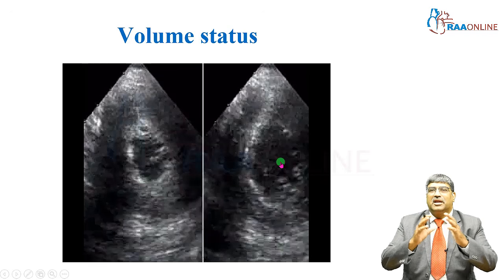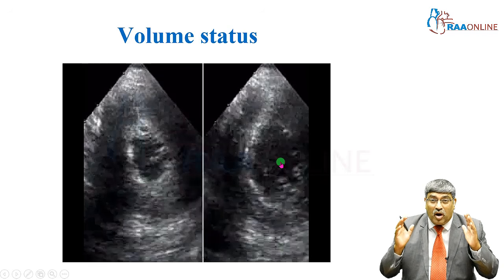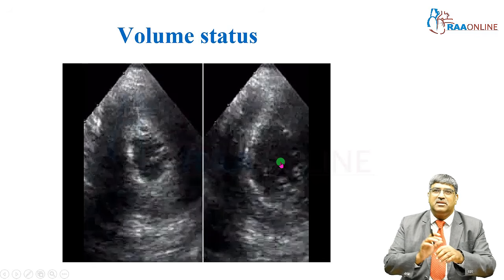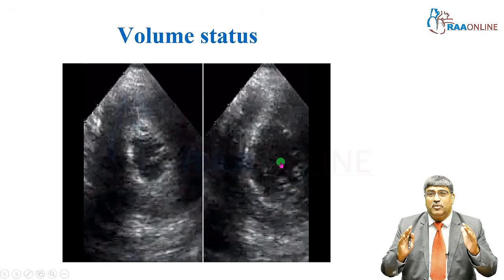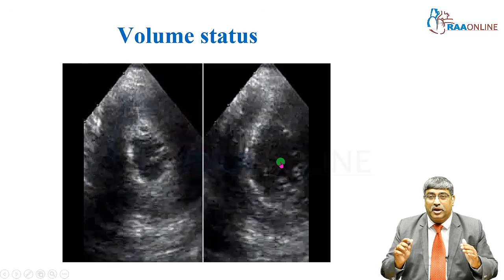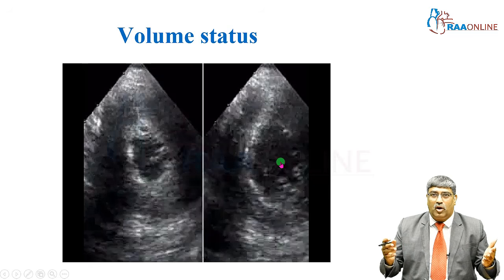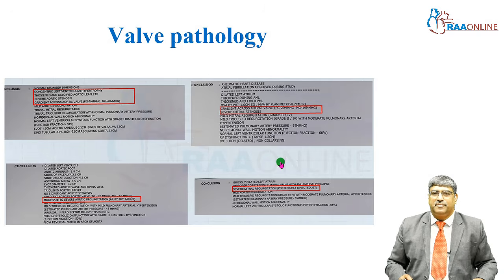The ventricle will dilate immediately, and if the ventricle function is not adequate, it cannot accommodate this sudden surge of volume. So always you should assess the volume status with the IVC diameter and fill the patient accordingly, or you have to look for dynamic indices of volume responsiveness, which is stroke volume variation or pulse pressure variation.